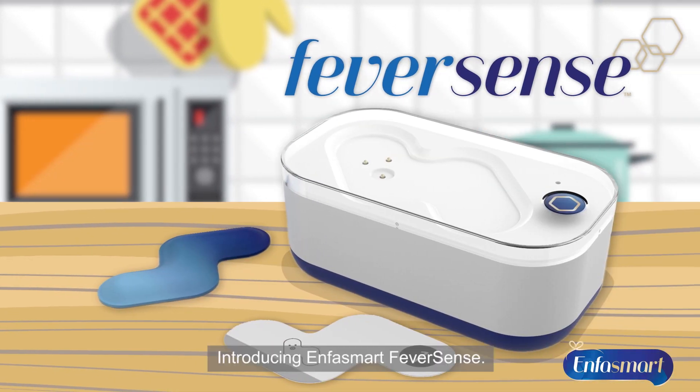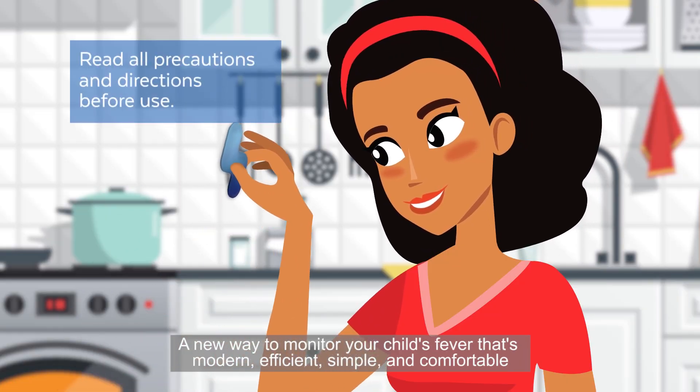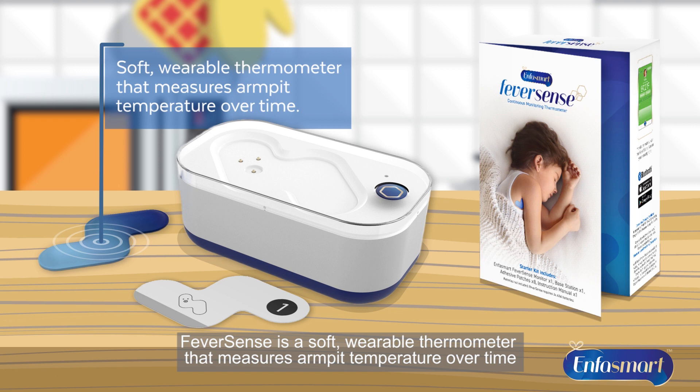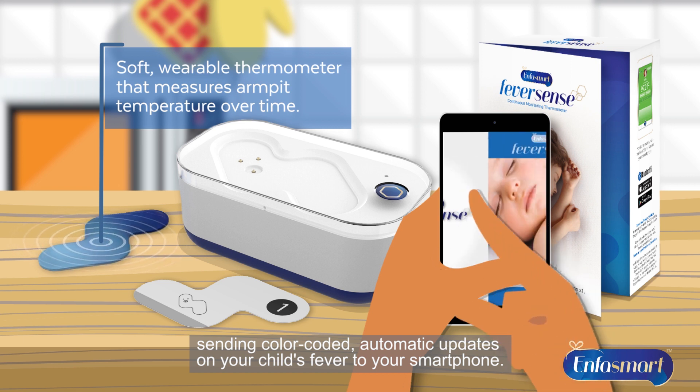Introducing EnfaSmart FeverSense, a new way to monitor your child's fever that's modern, efficient, simple, and comfortable for your baby while giving you peace of mind. FeverSense is a soft, wearable thermometer that measures armpit temperature over time, sending color-coded, automatic updates on your child's fever to your smartphone.